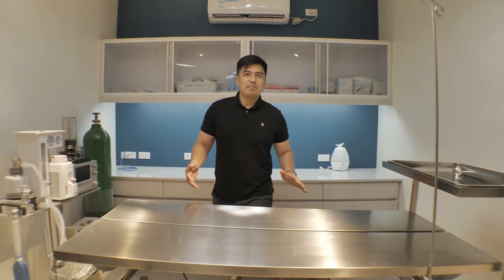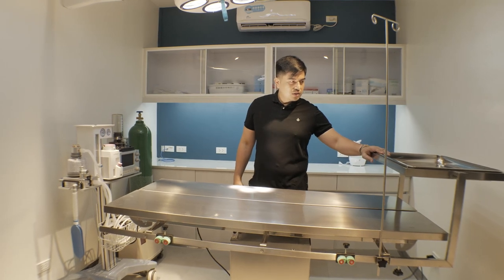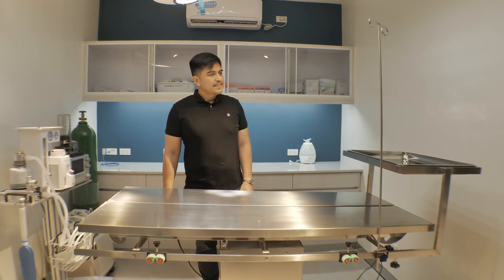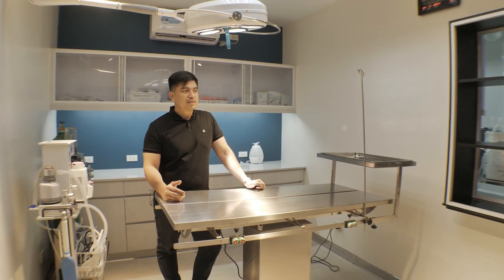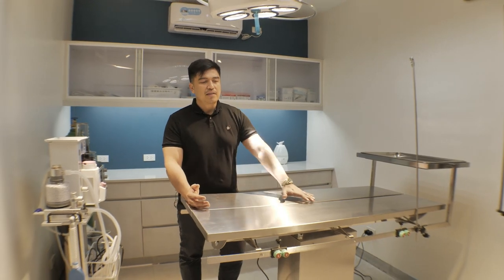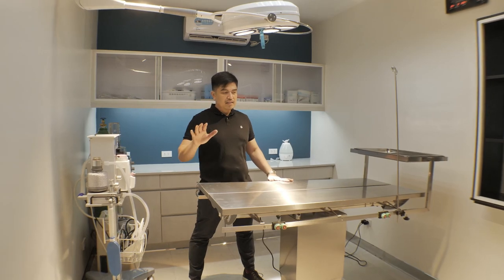All right. So, medyo happy ako dito sa surgical table nito. Not only that it is big, it can actually handle heavier animals. Meron din siyang installed na table dito sa gilid, so where to put our instruments and, you know, surgical equipment. Also, this table is actually heated. So kapag animals are under anesthesia, they lose body heat, no, as a side effect of that. So we usually install pa yung heaters or bear huggers just to keep their temperature warm. With this table, hindi na natin kailangan because it actually has a heater installed here.